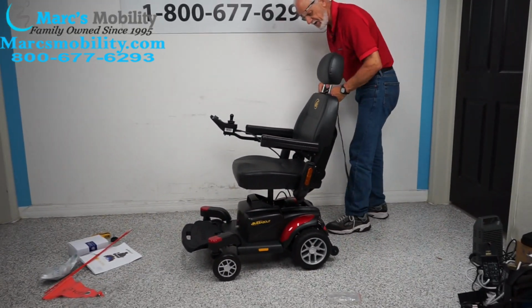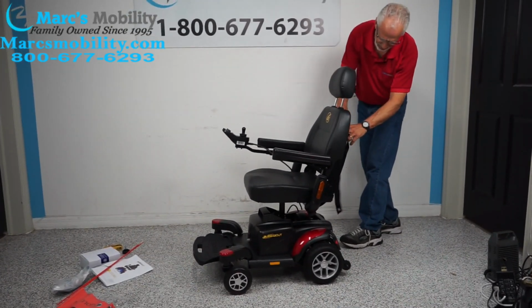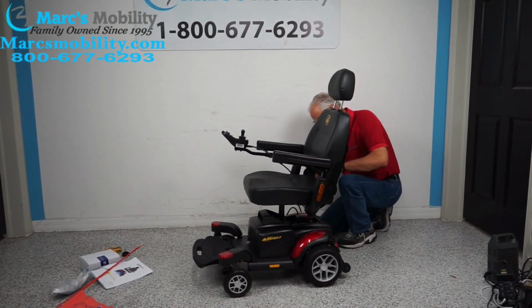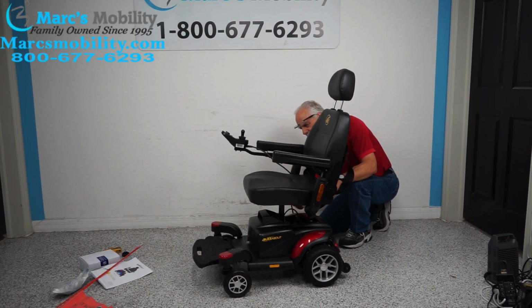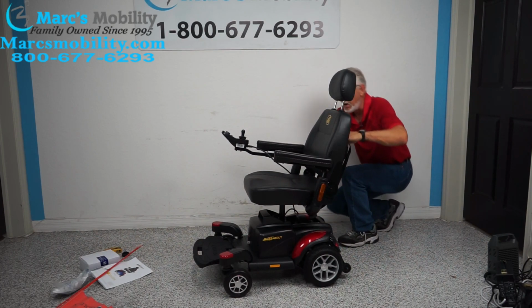I'm going to do this side here, and what I do is I put the safety belt in the back pouch. Okay, so I'm going to loosen up this one so this chair is completely put together. And as I said, it comes in two colors, red or blue. The blue part is on the floor over there next to the charger and the flag and the manual. Let me tighten this up. There we go, and the belt is in the back pocket.